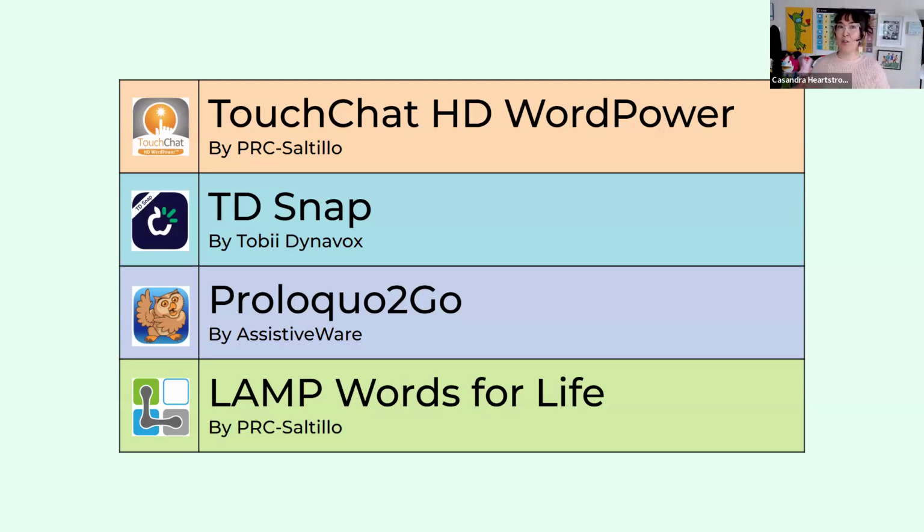We really have to, which is hard because our jobs are already very difficult, be open to learning about these different apps, because we bear that educational responsibility to the children. We should learn some different techniques and different apps rather than putting that on the shoulders of our students.